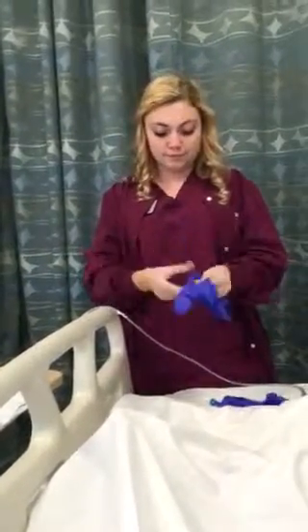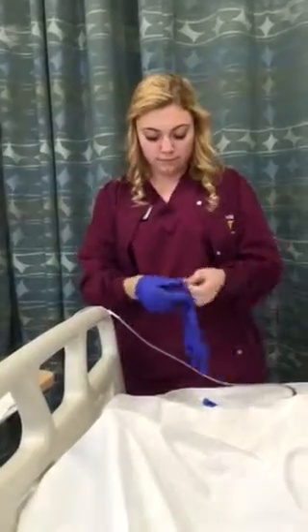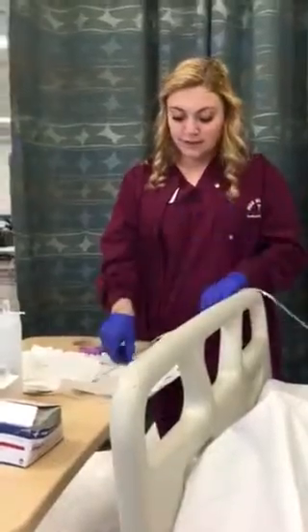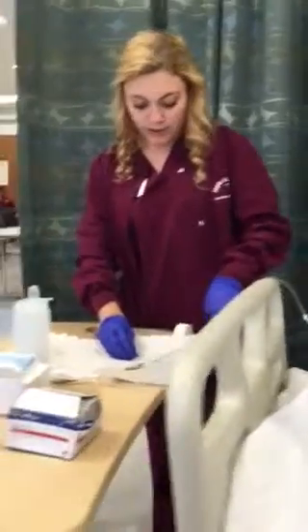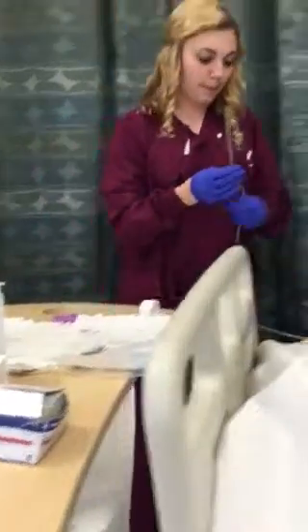So I'm going to go ahead and drag this. Make sure this is underneath. I'm going to perform hand hygiene and put on my gloves. I also performed hand hygiene before I entered the room. So I have my tube. I'm going to go ahead and drag it and rotate it through the lubricating jelly. Make sure it's going to be good to go.